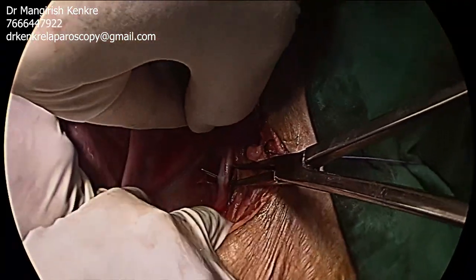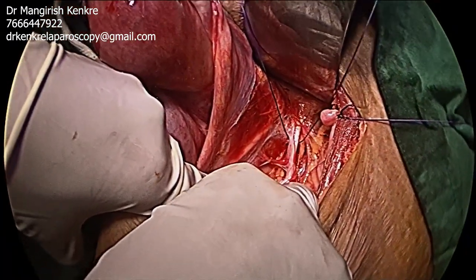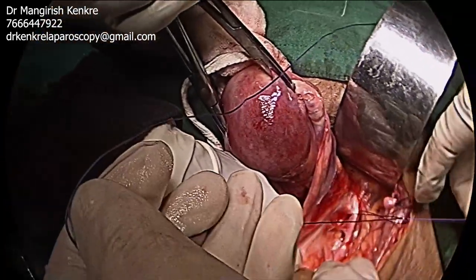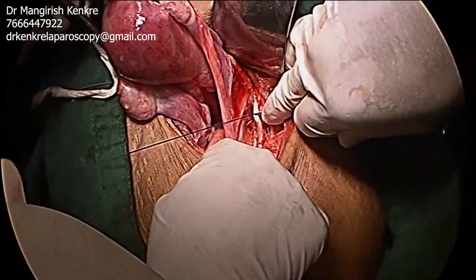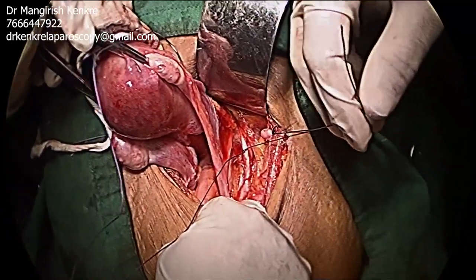Suture material is then passed underneath the anterior division of the internal iliac artery. One can either use a polygalactin suture or a silk suture. One can either put a single ligature or two ligatures.